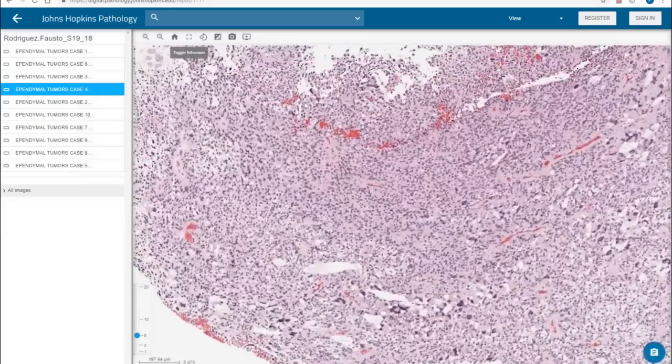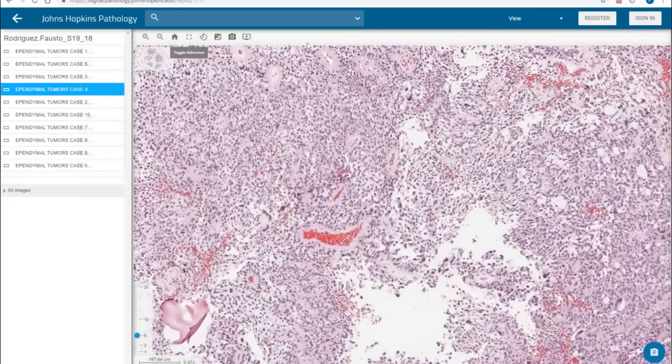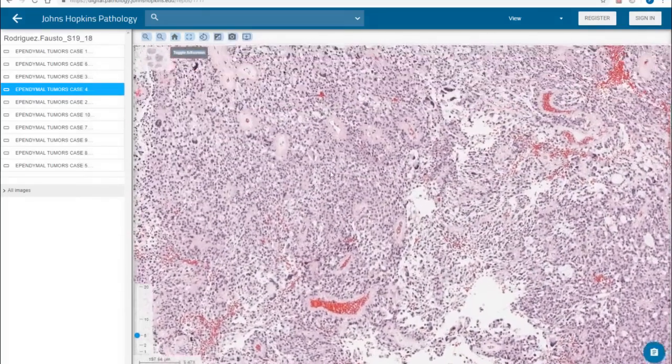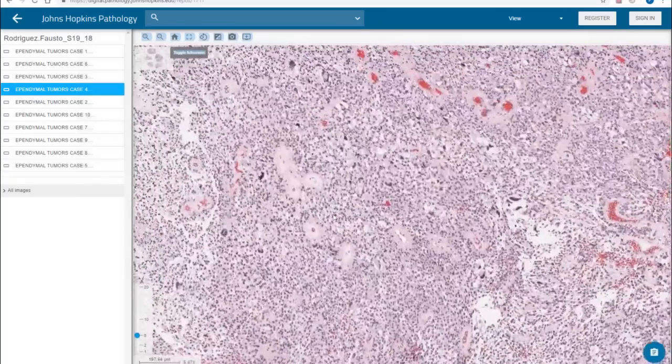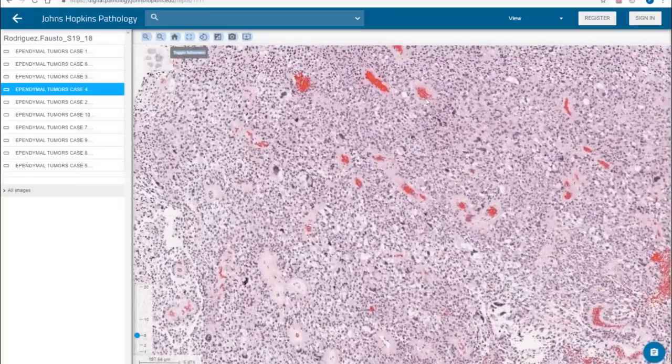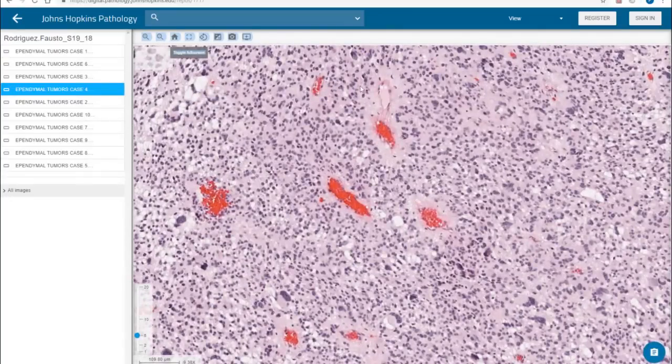All right, so we are again seeing a theme of ependymal tumors. You see how frequent these features are, and are these pseudorosettes. When you start seeing that, you have to at least think of ependymoma as a very high possibility. Here, it looks like you have this fibrillary background.